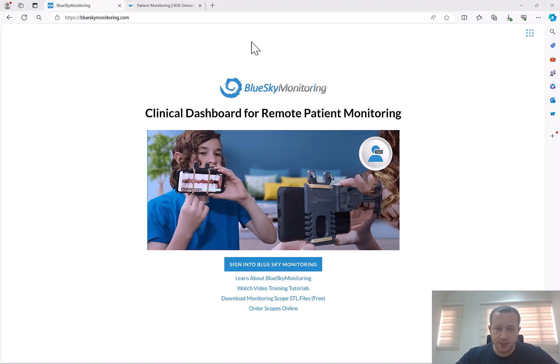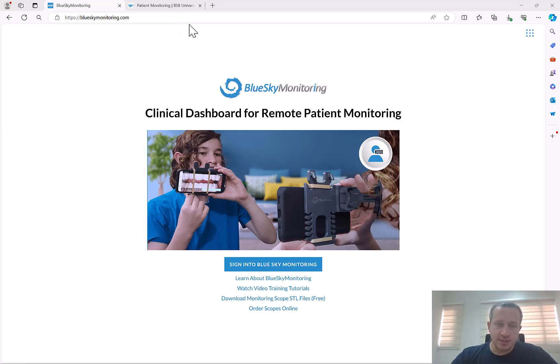Hello everyone. We've made very significant updates to our Blue Sky Monitoring clinical dashboard for remote patient monitoring for aligner treatments. One of the significant improvements is a new simplified and streamlined way of passing the relevant STL files and data into the Blue Sky Monitoring remote patient monitoring platform. Since there's so much innovation going on, let's take two minutes to organize and describe what is going on.